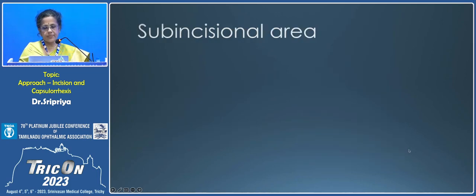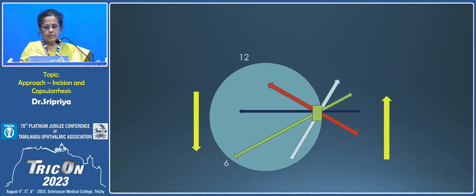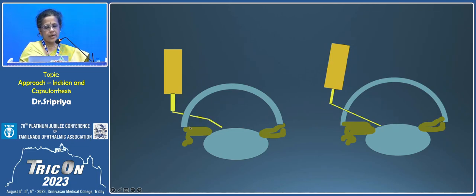And vice versa. Coming to the subincisional area, which is the Waterloo of every surgeon, remember that your instrumentation is, the side port is the fulcrum. So when your cystitome tip is at 6, the syringe should be at 12 and vice versa. And remember, you have to use it as a seesaw. So when the syringe moves towards the center, the tip can touch the cataract. The third bend also helps in the same way.